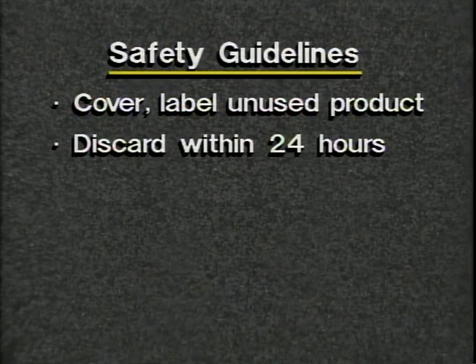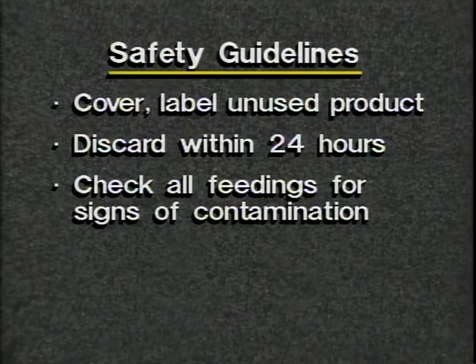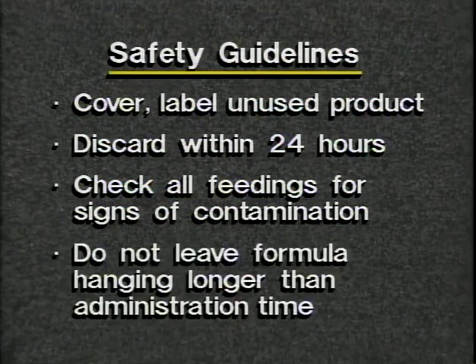Discard unused open product within 24 hours or according to the manufacturer's guidelines. Check all feedings carefully for signs of thickening, lumps, or separation, which may indicate microbial contamination. Do not leave the formula hanging in the pump longer than the scheduled time of administration.